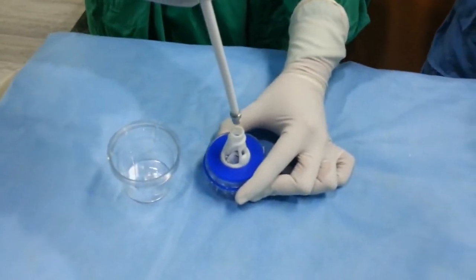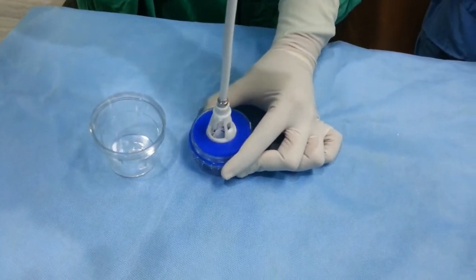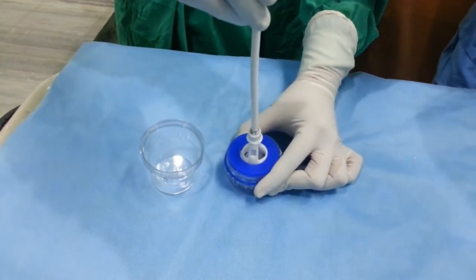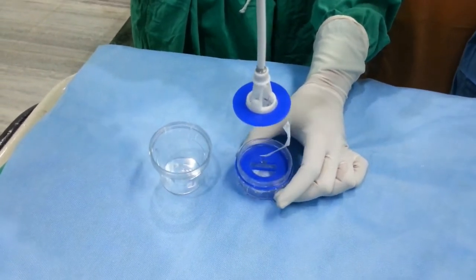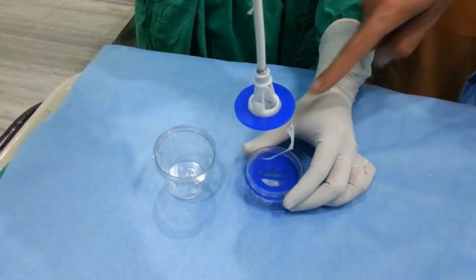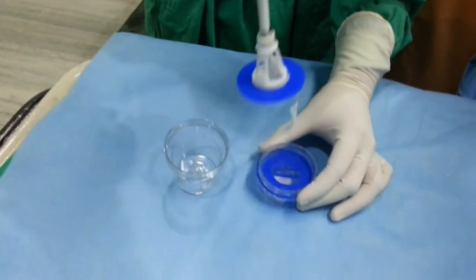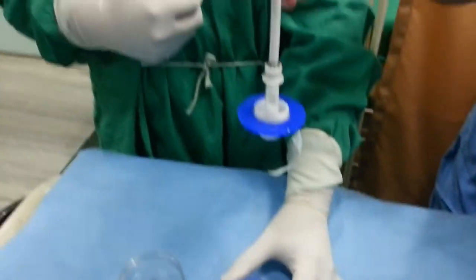And with the same right hand, which has now become free, she puts the holder in a corkscrew fashion in the clockwise direction. At this point, she can lift it out of the casing. And you see there's a plastic casing. She takes that off. Next, watch. See, the valve is carefully placed within a plastic frame, the leaflet being inside this plastic. And she takes it all out.